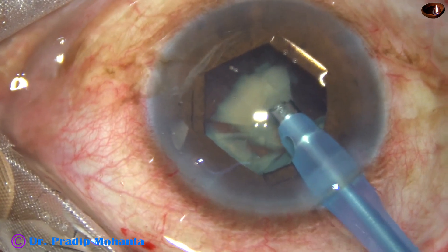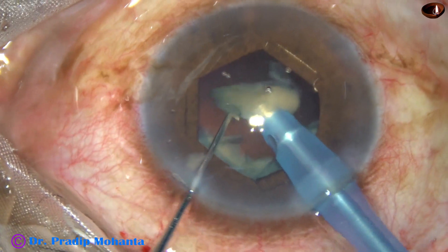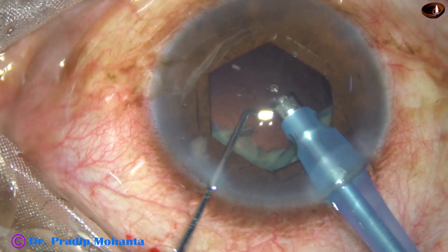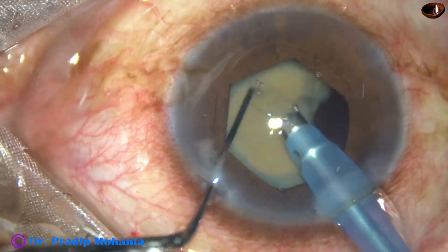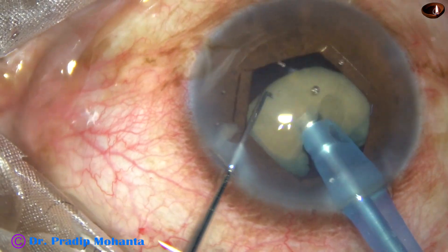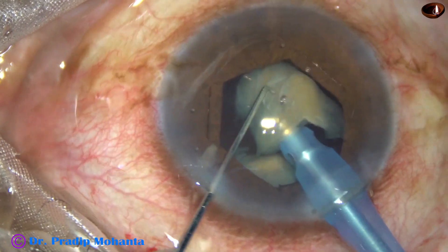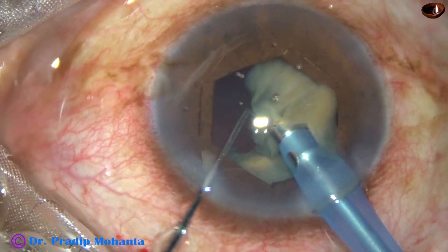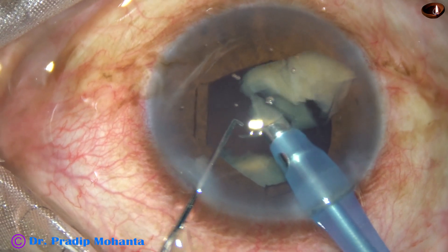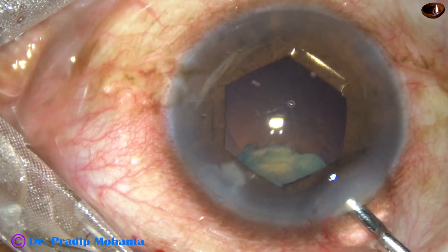The fragment at the center is being emulsified. The machine being used is Oertli Catarex 3. Ultrasonic power is 60%, flow rate is 40, and vacuum is 400 mmHg. This is the big chunk — making the bevel sideways, engaging it and dividing the nucleus into two parts. Now this fragment is being emulsified.